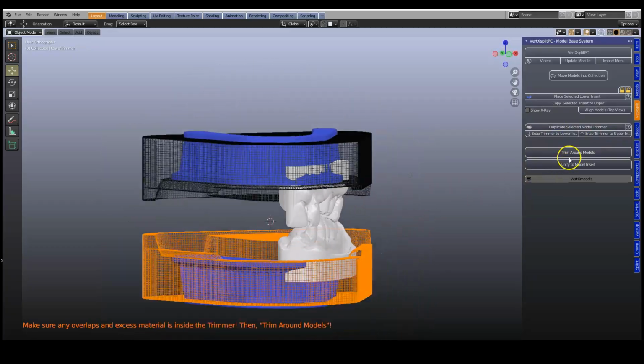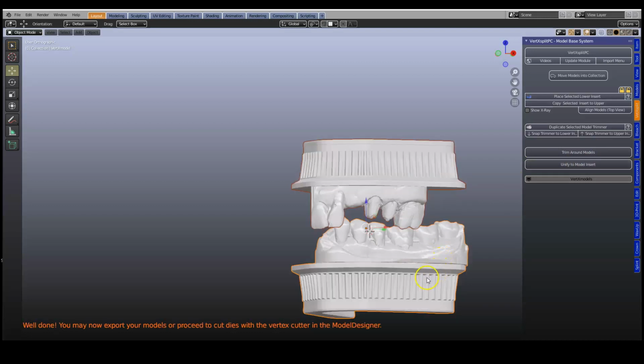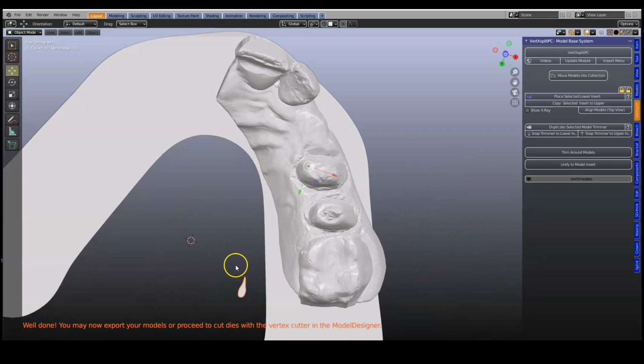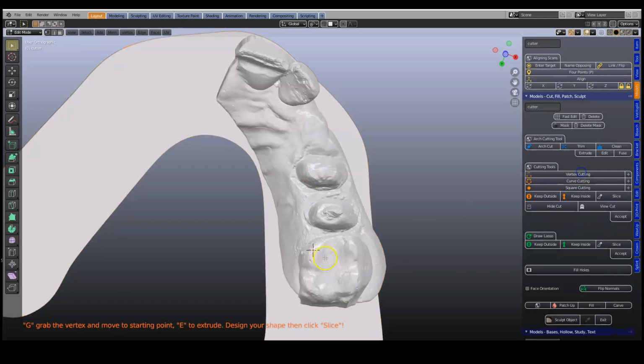Then what we're going to do is we're going to trim around the models and we're going to unify them. Okay, so that's looking okay, and unify. So far so good. Okay, so then we're going to hide this and we're going to go into the vertex. Here's a thing that we can delete and we're going to split them up. So I'm going to take that one up there. Model designer. Go to the vertex cutting.